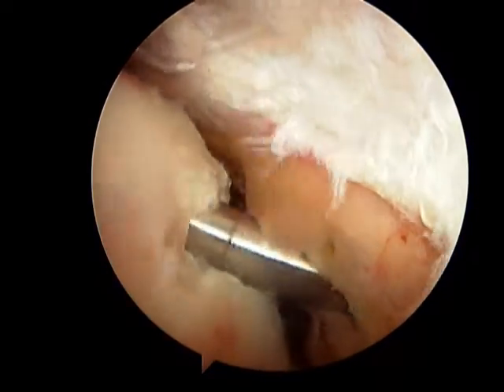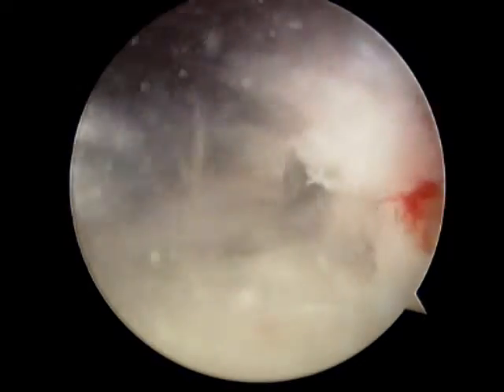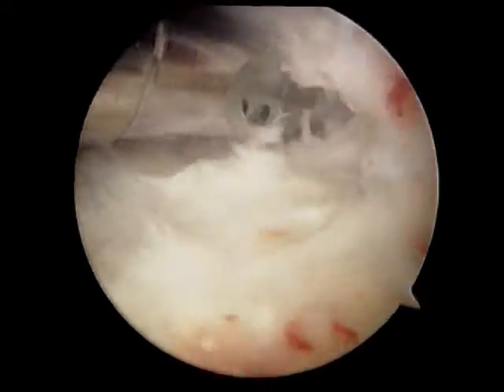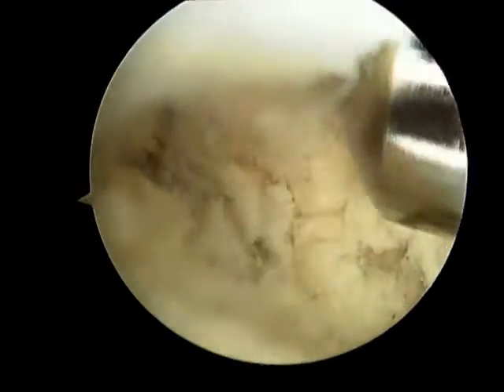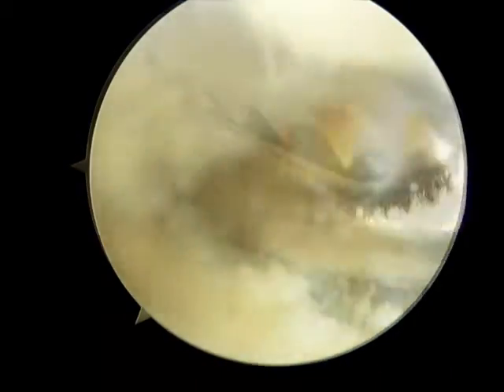Here we are using a 4mm shaver to debride the supraspinatus tendon where the calcific material is. You can see it is very fluffy and very easy to remove once you know where it is. Another case shows a more turgid calcific material.